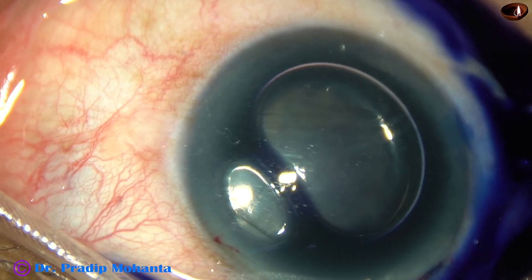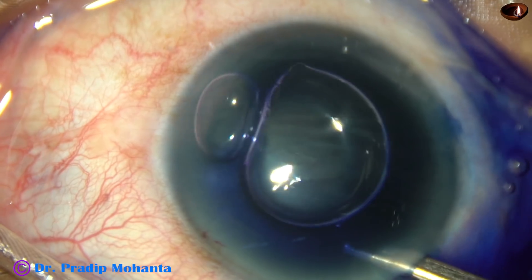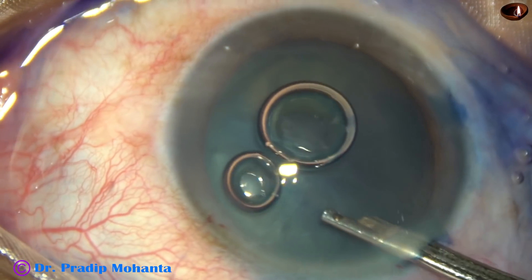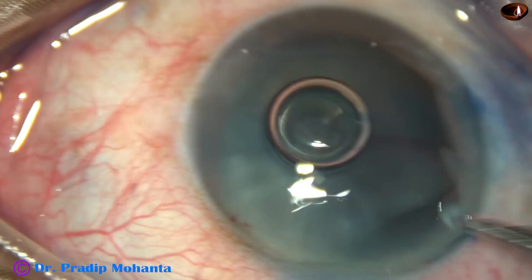trypan blue dye is sprayed over the anterior surface of the cataractous lens. And now, the dye is washed out. This is real time, and this much time the dye was in contact with the anterior capsule.